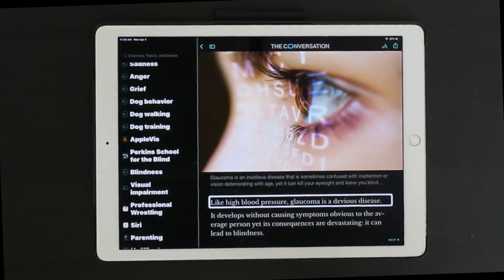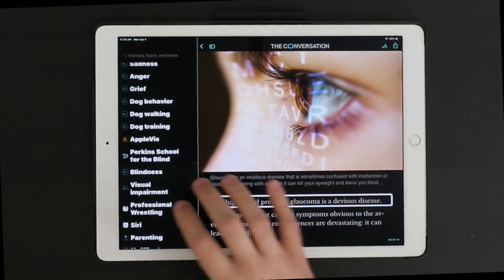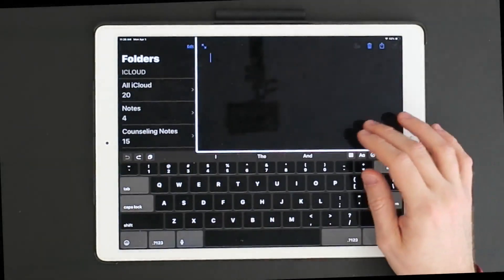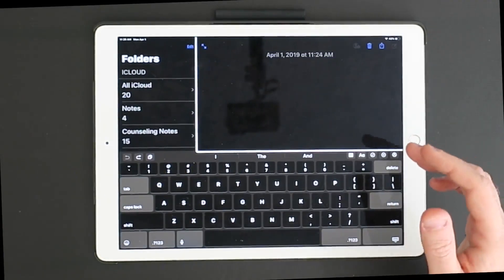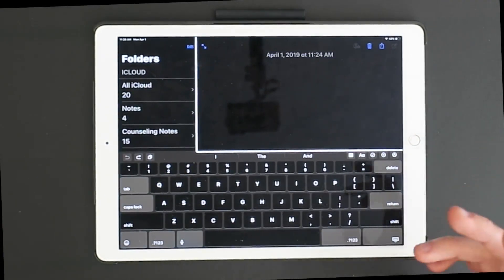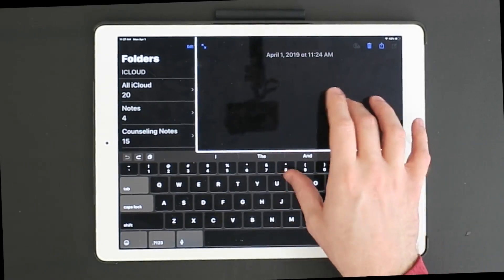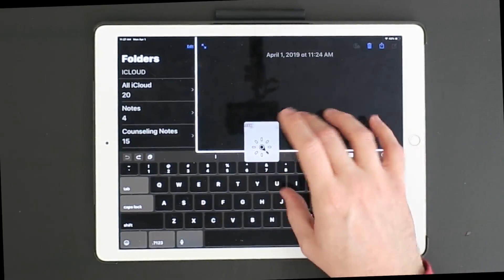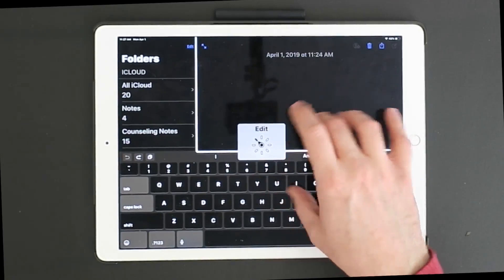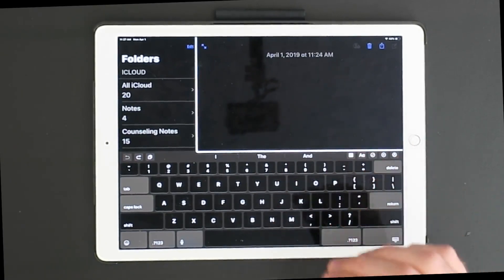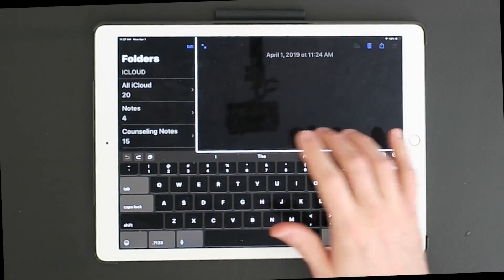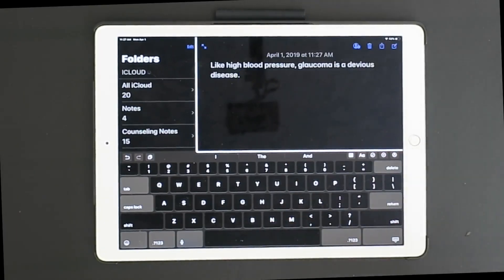So now we're going to go over to Notes and paste it in there. [VoiceOver]: "Notes... note text field April... note text field is at insertion point at end." Now I'm going to paste it. The easiest way I find is using the rotor. I'll turn it to Edit, then swipe up or down to find Paste, and double-tap with one finger. [VoiceOver]: "Like high blood pressure, glaucoma is a devious disease. Body, 37 point, dark gray, natural alignment, indentation."